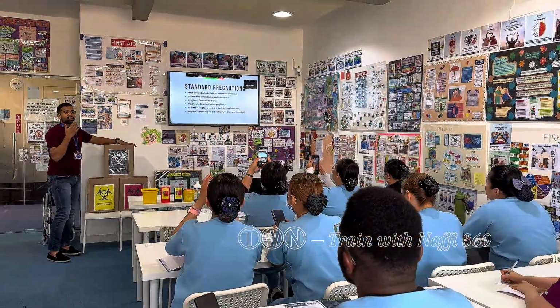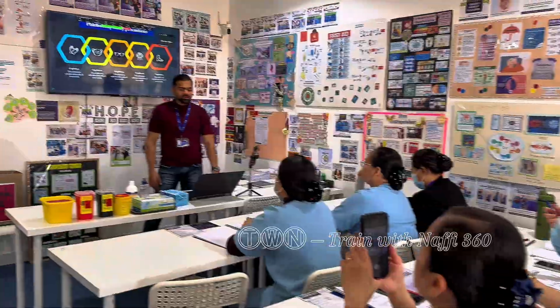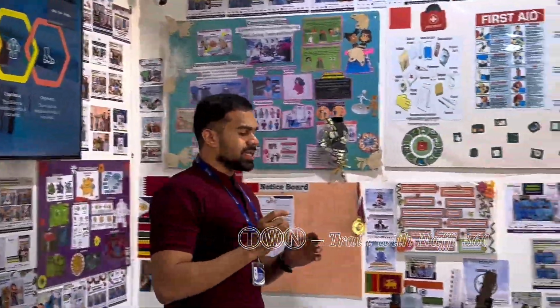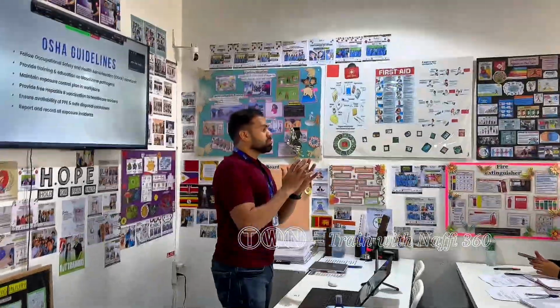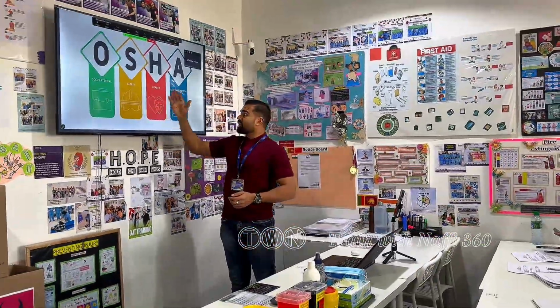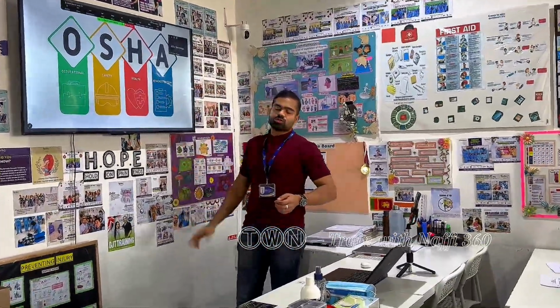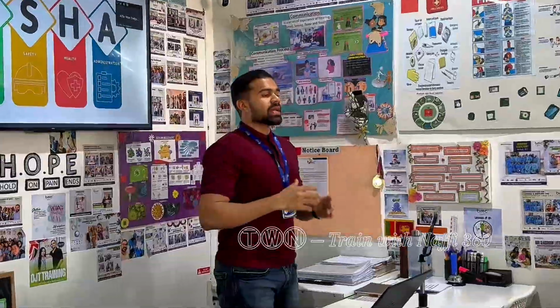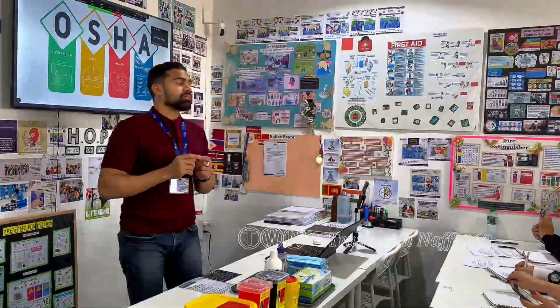Performing proper hand hygiene is essential. Hands must always be washed before and after the procedures. Remember, gloves should always be worn when handling blood samples, and any cuts or open wounds must be properly covered to avoid exposure. Students are also reminded to avoid touching the face, eyes or mouth during phlebotomy procedures, since this can lead to accidental contamination. So always remember to perform proper PPE hygiene while you perform the task.